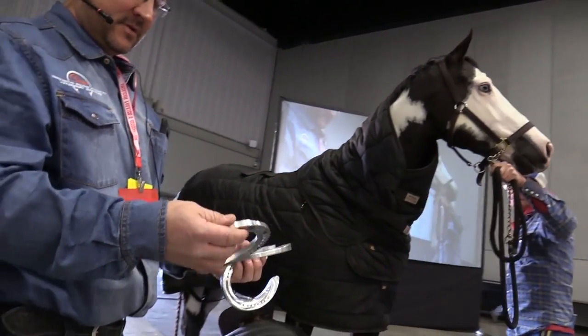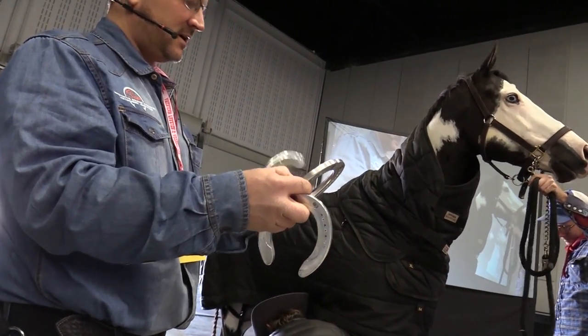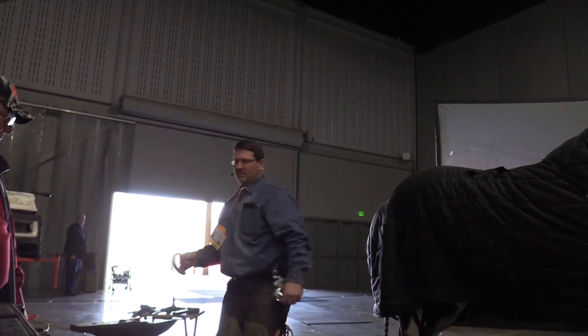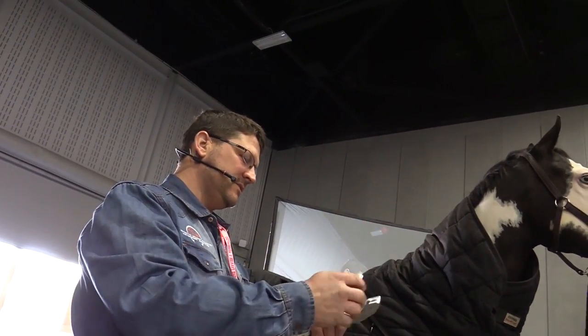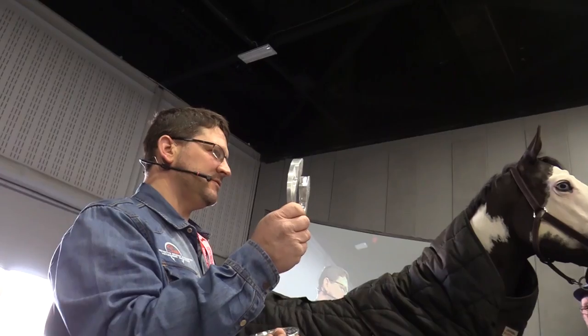I like these KB aluminum wedges because they're a nice blank slate. I can do a lot of forging modifications to manipulate these. They're pretty affordable. There are some shoes that I have built out myself that have a lot of these modifications built into them. I make them in a 4 and a 6 degree. I used to hand make all these, but it's a lot easier to have a machine make them. In my upper level cases, I'm using 4 and 6 degree wedges that are actually rockered.